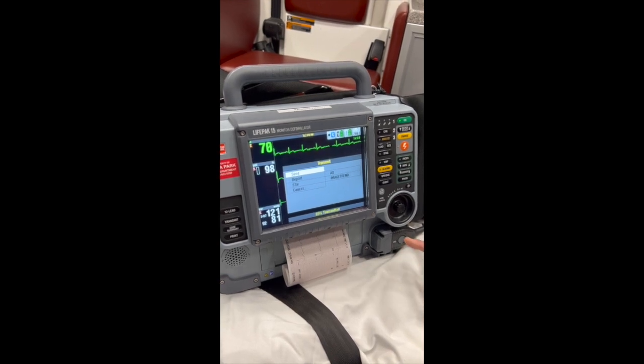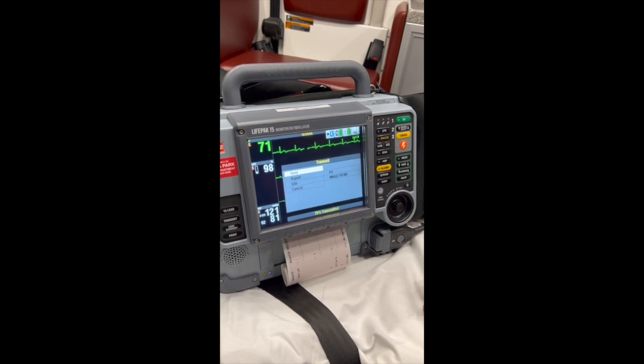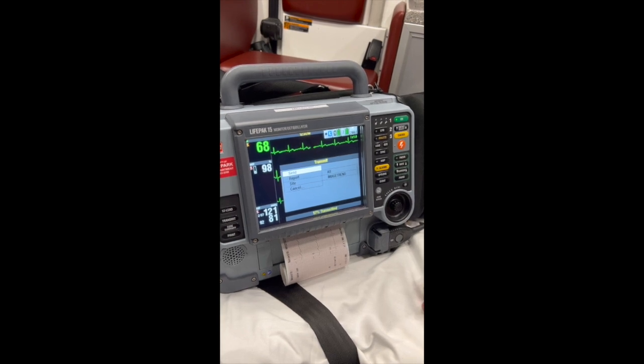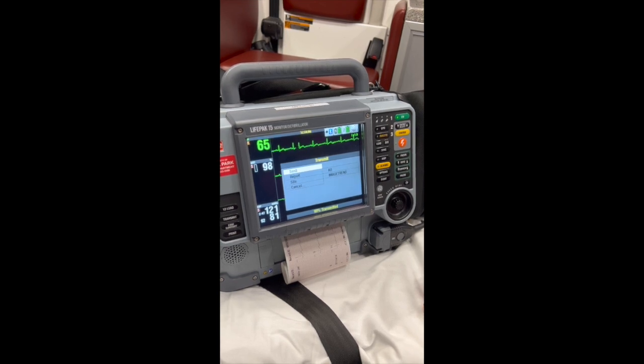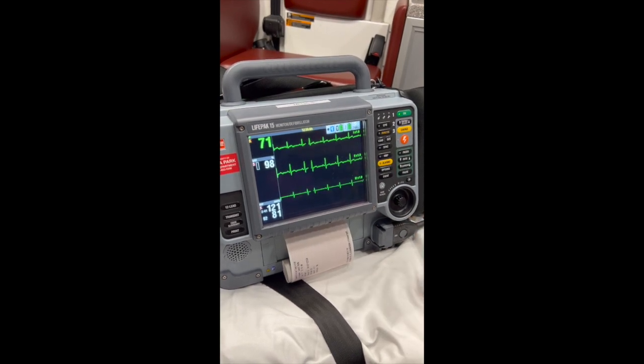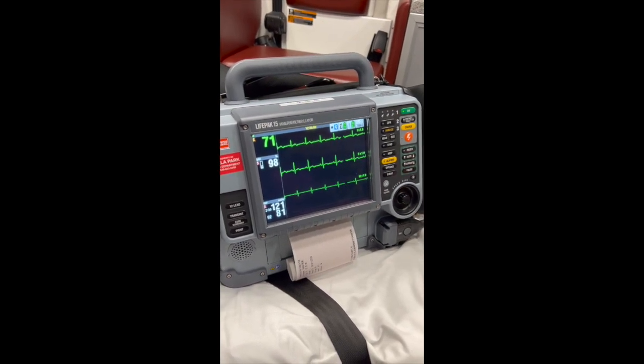And once this is complete, we'll show you how to send after the monitor's been shut off, if it's inadvertently been shut off. All right, so transmission complete. It's been sent to ImageTrend, and in another video, we'll show you how to pick that up in ImageTrend.